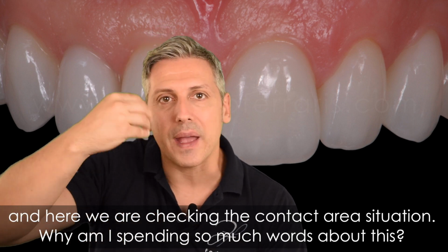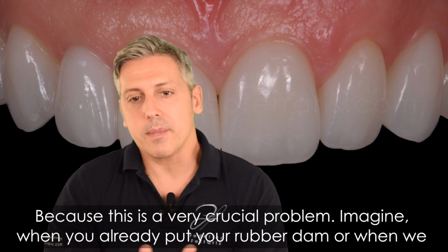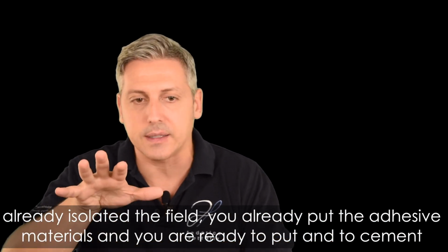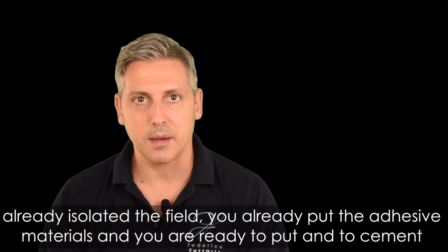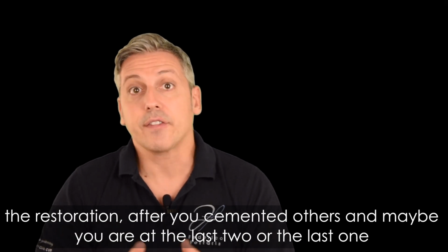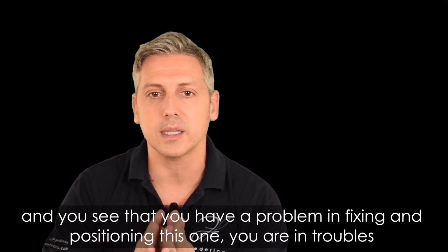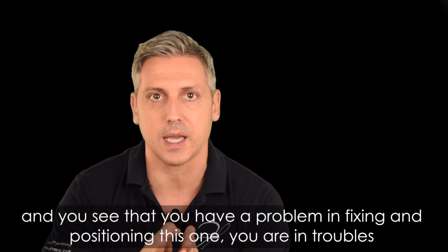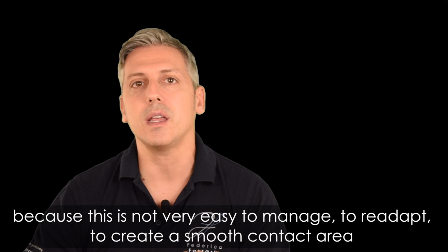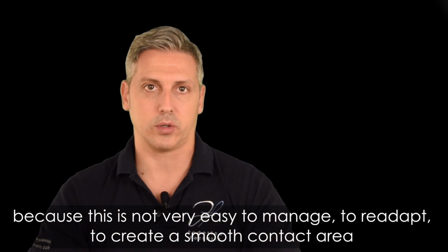Why am I spending so many words on this? Because this is a very crucial problem. Imagine, you have already put your rubber dam, or anyway already isolated the field, you have already put the adhesive materials, and you are ready to cement your restoration after you cemented the others, and maybe you are the last one, and you see that you have a problem fixing and positioning this one. You are in trouble, because this is not very easy to manage, to readapt, to create a smooth contact area.